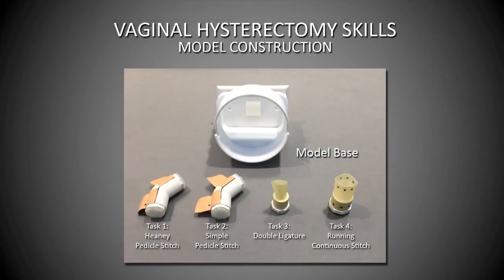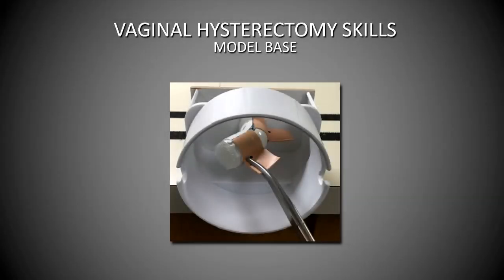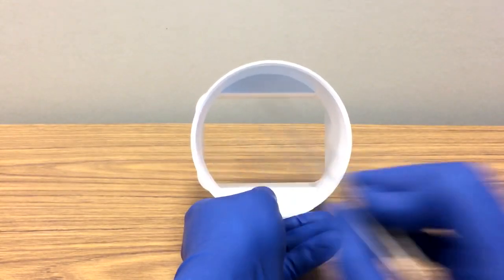The model consists of a PVC base and various inserts for each task. Model construction materials are illustrated here and are easily available locally or online. Notches are created at the 3 and 9 o'clock positions in the downspout adapter to hold the clamps.